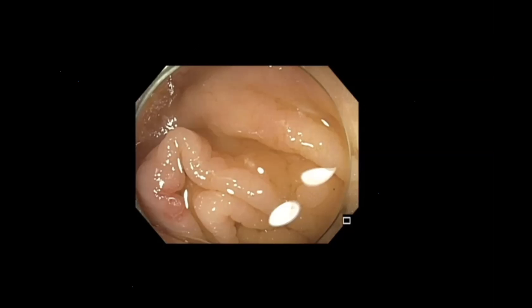Of all the perforations that happen in a colonoscopy, APC-related perforations in the cecum tend to end up with a colostomy. The reason is, when you do APC, everything looks good, you come out, and the patient goes home.